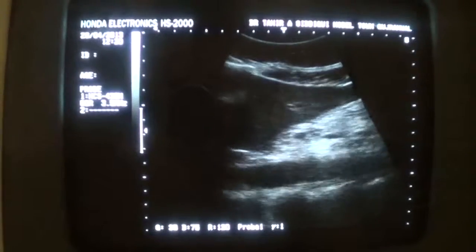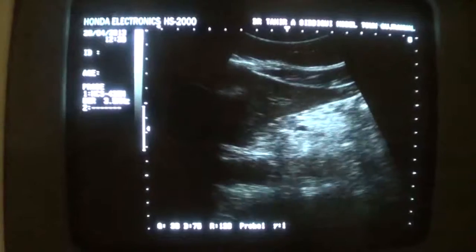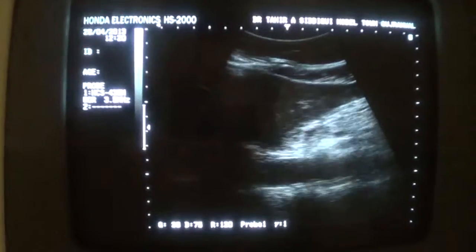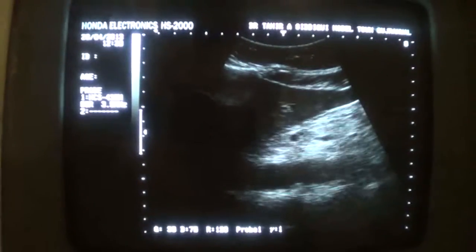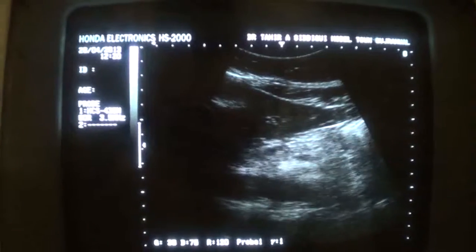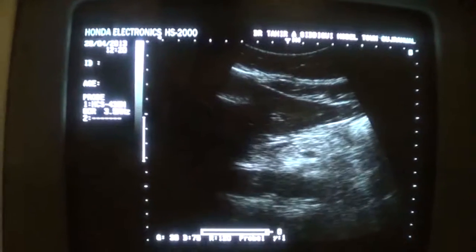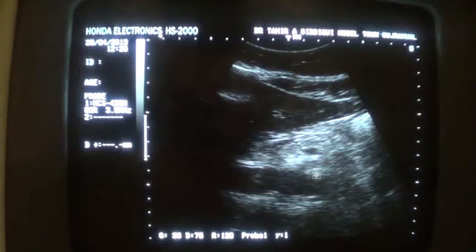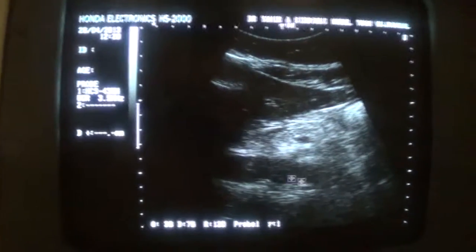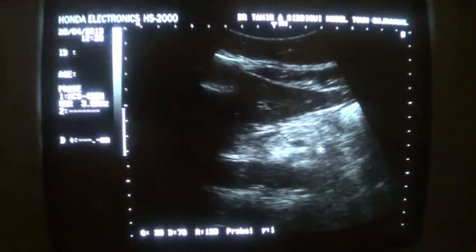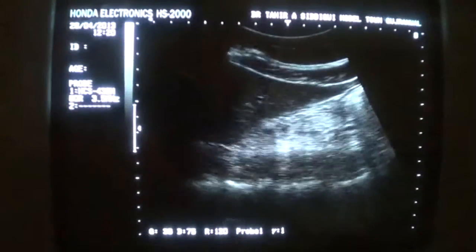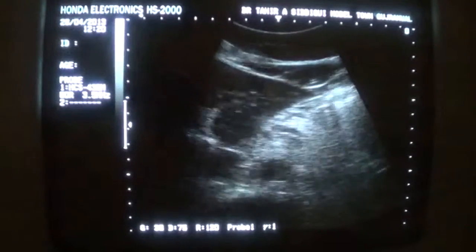And in the longitudinal section, this is the head of the pancreas. This is the aorta. Superior mesenteric vein. And we do not see any lesion relating to the pancreas.